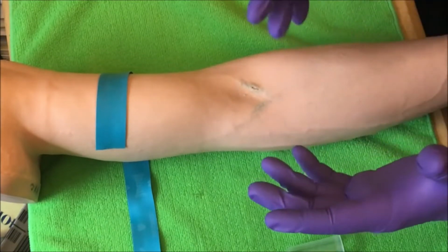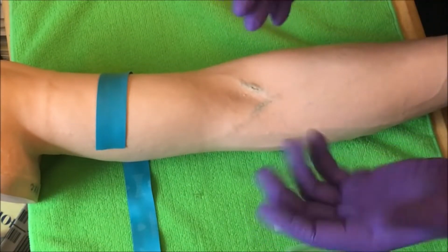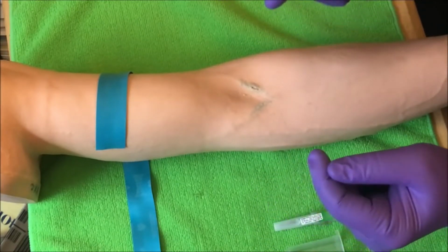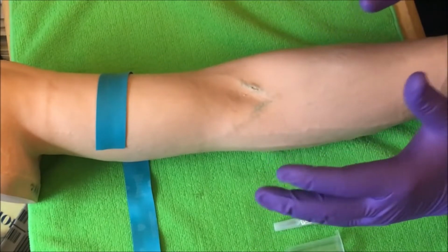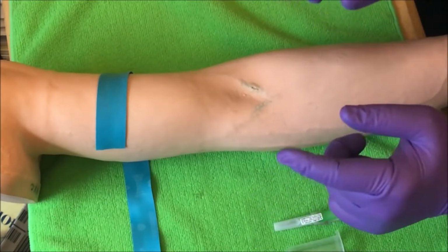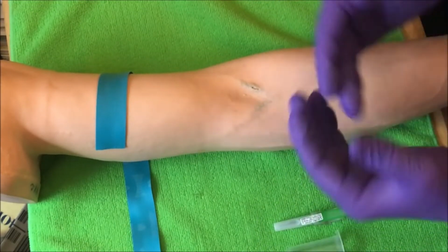I like to assess the arm, both arms. I like to tie the tourniquet on with my gloves, like you saw earlier, and then I like to palpate and look for a vein on either arm. And once I find a vein that I'm comfortable with, then I release my tourniquet and I proceed to get my equipment and assemble, letting the arm rest.